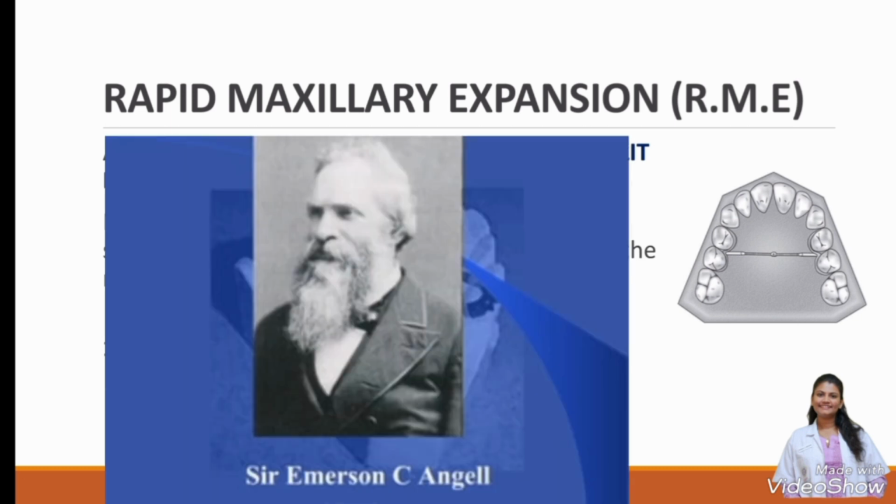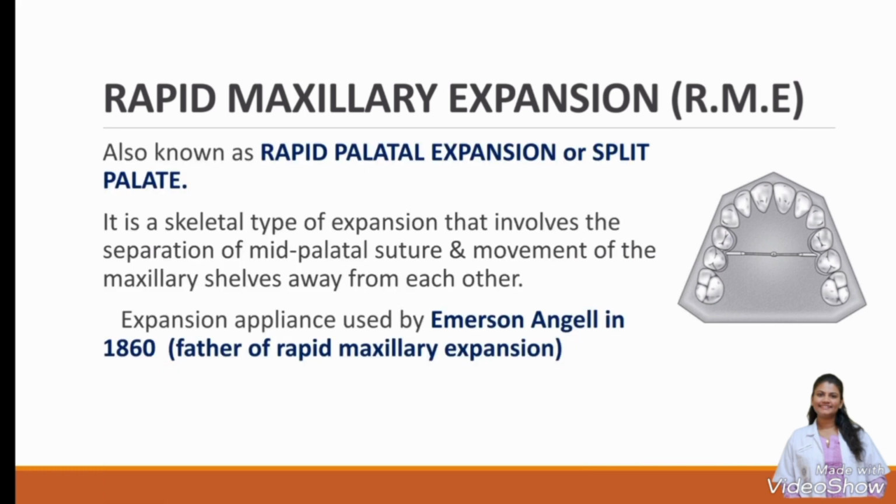In 1860, he used an expansion-like device in which a jack screw type of device was used between the maxillary premolars in a 14-year-old girl child, which achieved an increase in arch width by 1/4 inch in 14 days. We can see that appliance photograph in the slide above.